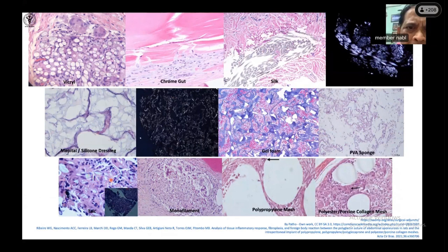Okay. Now the sutures you will find nowadays, most of them are rounded, almost similar to each other. These are called monofilament sutures. They are either Vicryl or Prolene sutures. So these are the common sutures. Both of them you can polarize and you can find them.